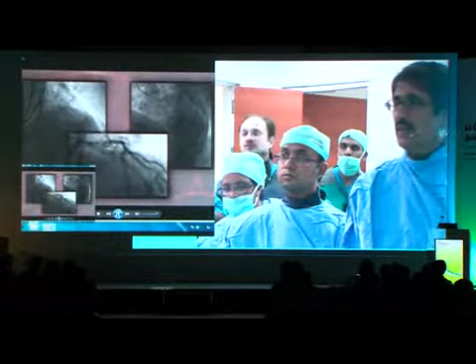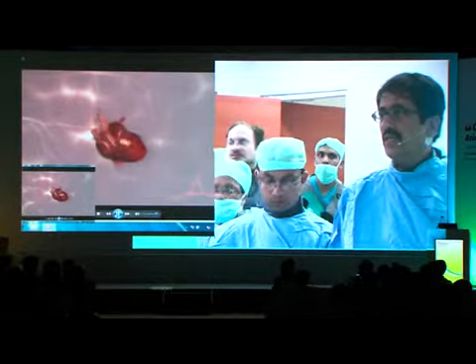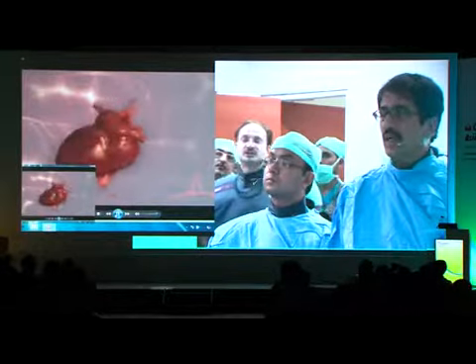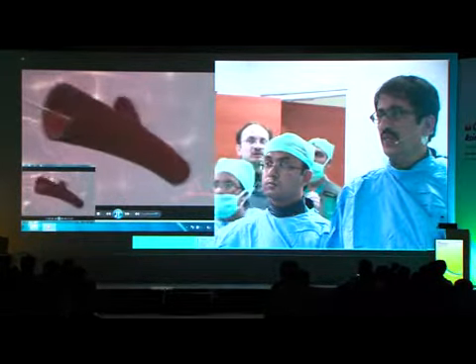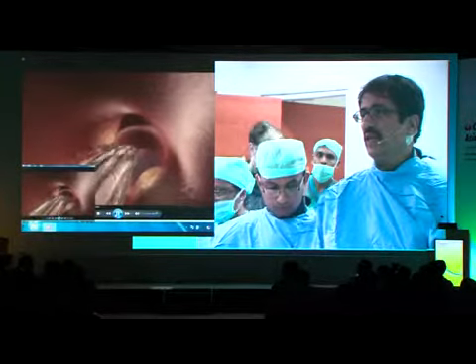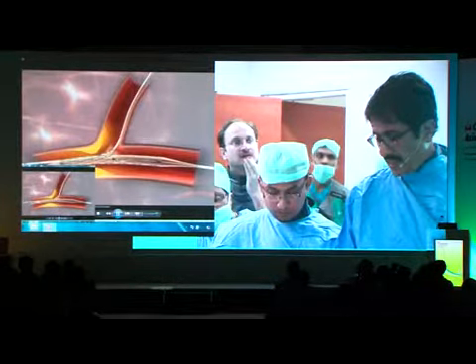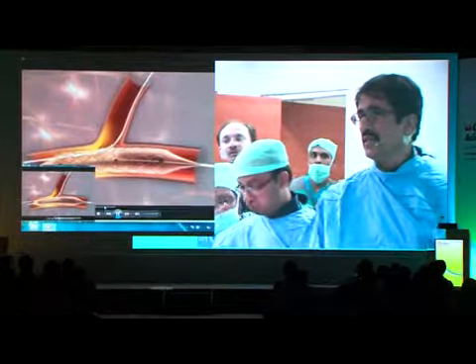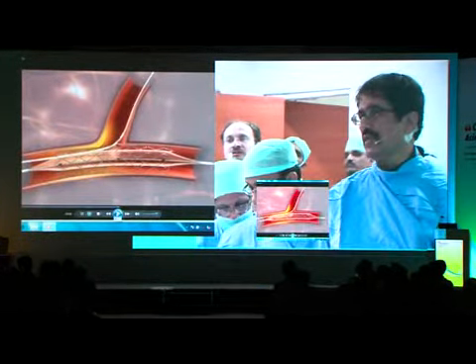So actually, we were at a stage where we're introducing the stent, and we had said that we will introduce the 8 millimeter length into the diagonal the reverse way. As such, it was very difficult. Let me explain. You see 5 markers on that.